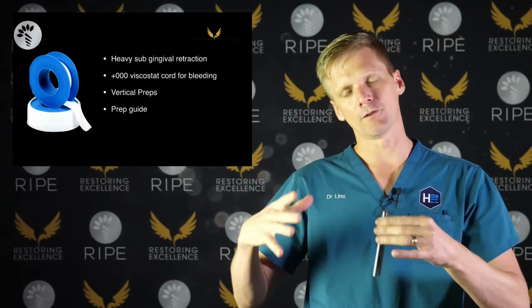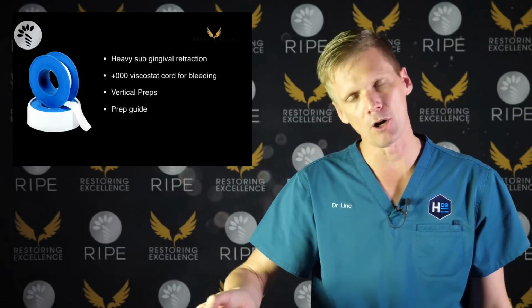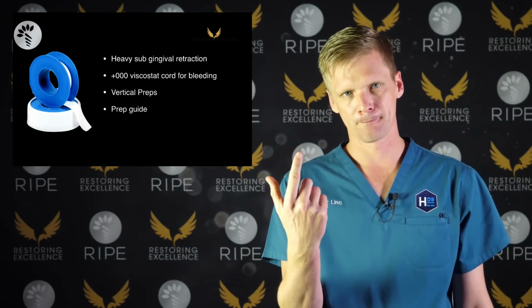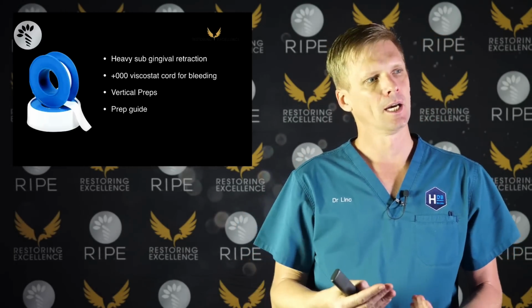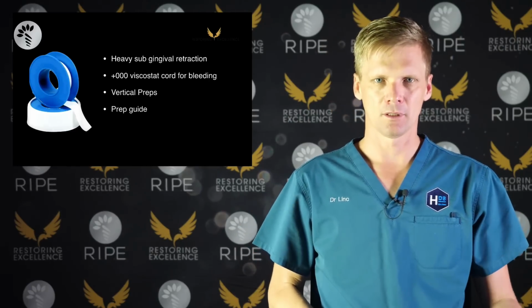So when you are doing vertical preparations with safe-ended burrs, you can ride on the top of the Teflon. It won't helicopter like cord will. So you can ride around and it will stop you going too far subgingival. So it maintains enough biologic width that you will not get inflammation afterwards.